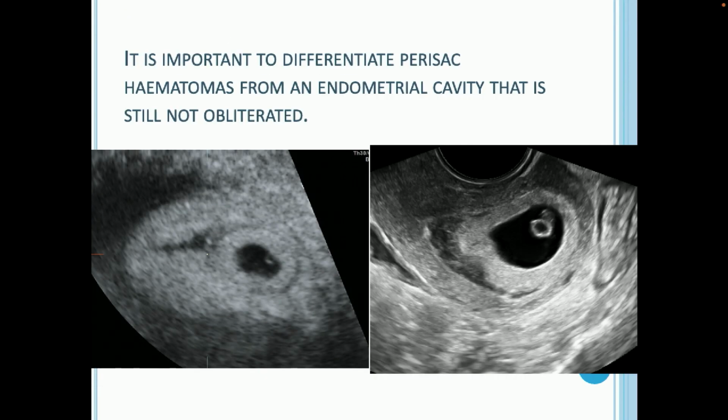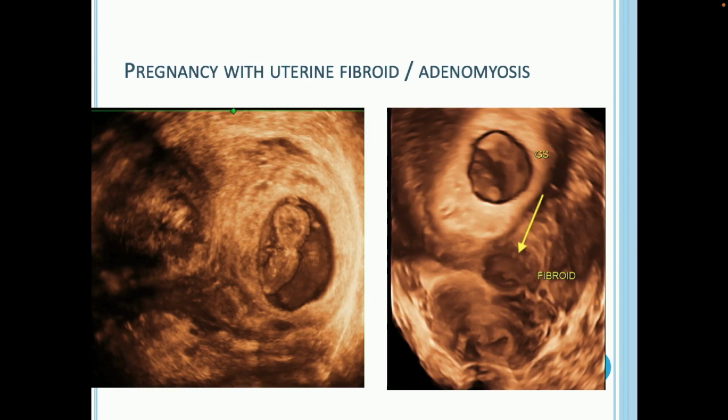But the hematomas which are smaller than covering 1/3 of the gestational sac, more towards the cervix rather than towards the fundus, and which are also under the chorionic leaf, that's when they are not of much harm to the pregnancy. But I said not of much harm, I didn't say no harm. So it is very important that you always counsel the patient with a proper safeguard. Even when you find uterine fibroids, or uterine adenomyosis, even these lesions, when they are under the chorion frondosum, are risky.